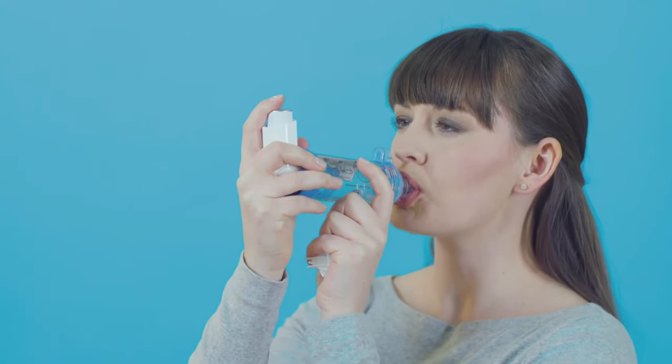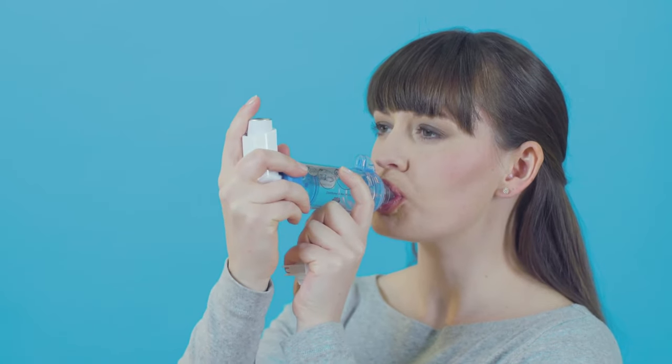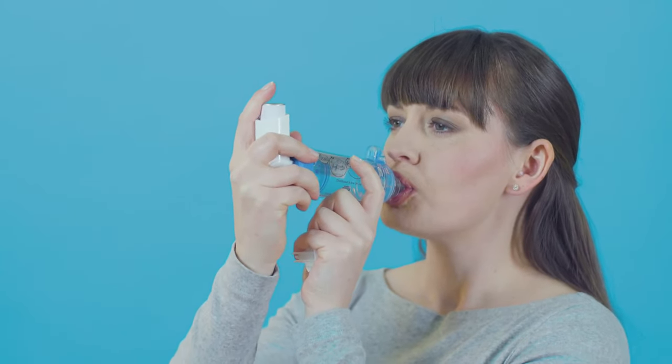Breathe out gently and slowly away from your inhaler and spacer until your lungs feel empty and you feel ready to breathe in. Put your lips around the mouthpiece of the spacer to make a tight seal. Press the canister on the inhaler once and breathe in slowly and steadily until your lungs feel full.